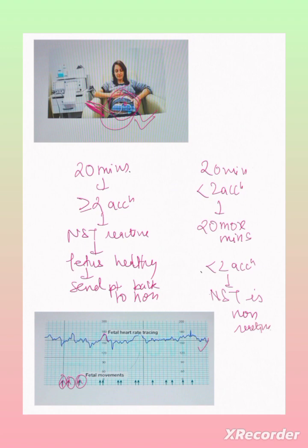And a non-reactive NST should always be followed by a confirmatory test. I've already told you at the start of the chapter, it is always followed by a confirmatory test. And what is a confirmatory test? A confirmatory test is a biophysical score. So that is why I told you that the most important parameter on the NST is fetal heart rate acceleration.